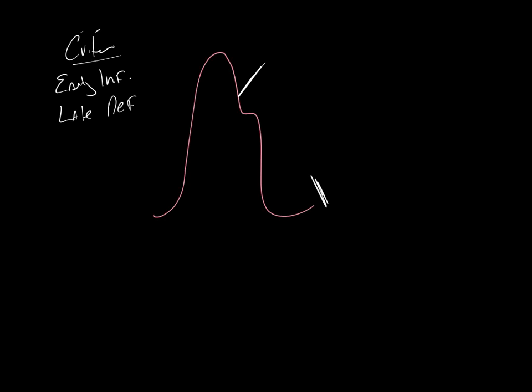With pulmonary artery catheter, I know I'm kind of skipping around, but what are some problems with misplacement of a pulmonary catheter? Wedge. So an inadvertent wedge, and you guys remember, here is my pressure and time. As I'm inserting the pulmonary catheter, I'm going to get a waveform that looks like that.